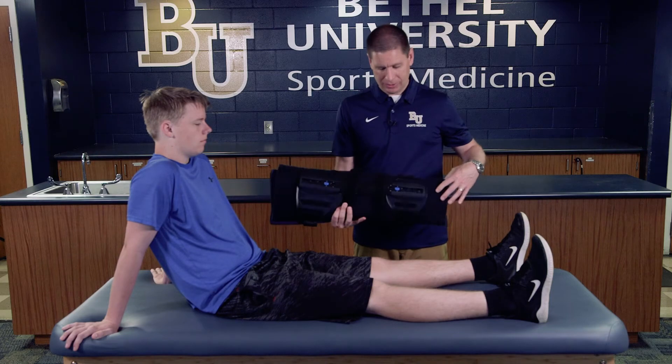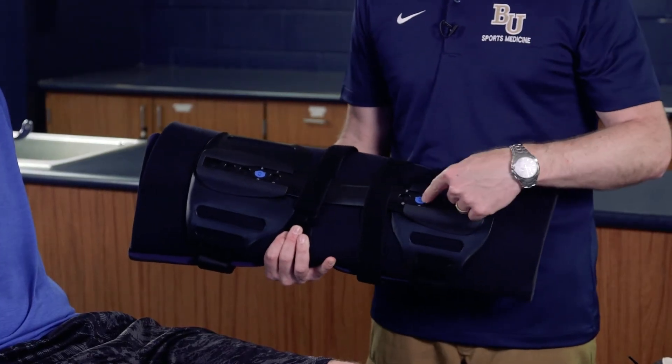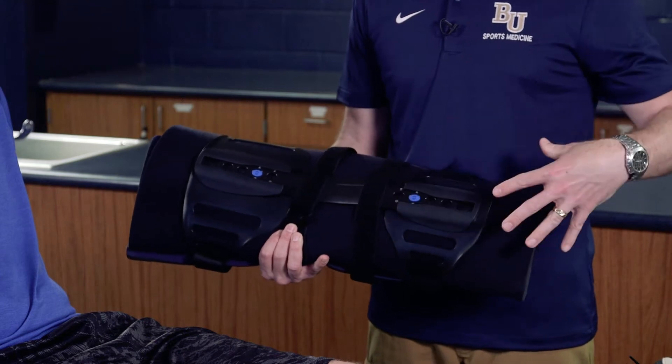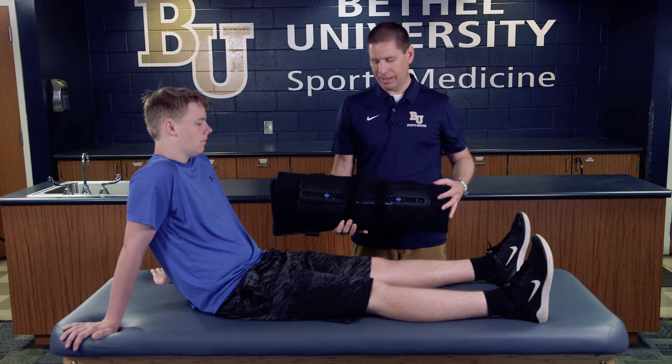This particular one actually allows you to adjust the knee immobilizer in terms of length. If you push in these buttons, it will slide out to make it either shorter or longer depending on the length of your athlete's leg.